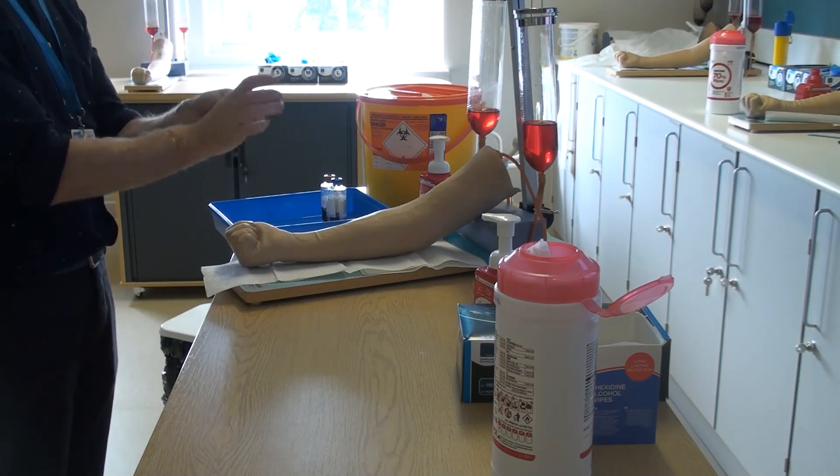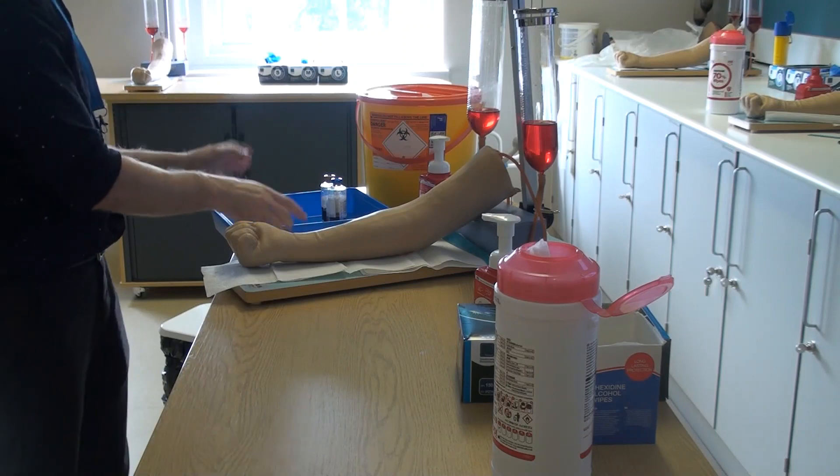Documentation of the procedure should be completed in the nursing or medical notes, ensuring that time, date, and sample site are recorded.